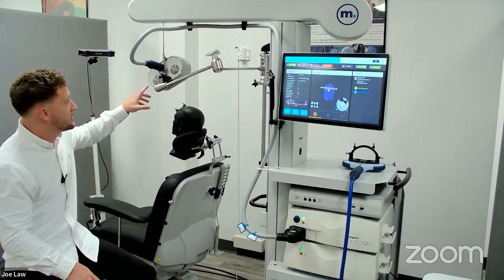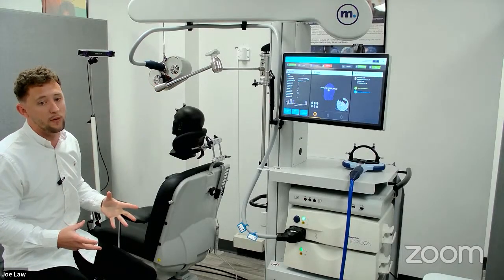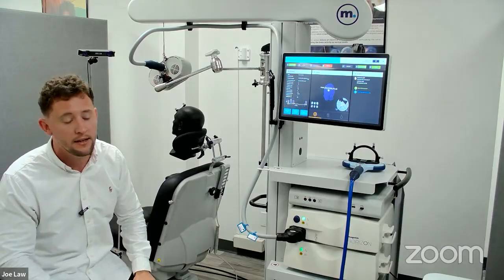The way this system works is there's two fans on either side, and they work on an algorithm. So when you first turn the system on and you're just doing a standard protocol, they're very much on a standby kind of spin.